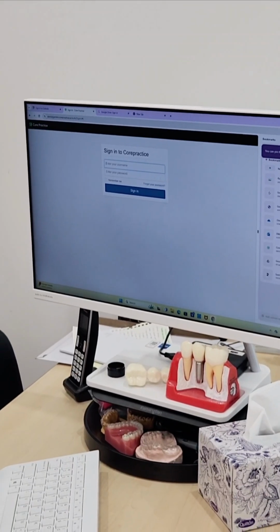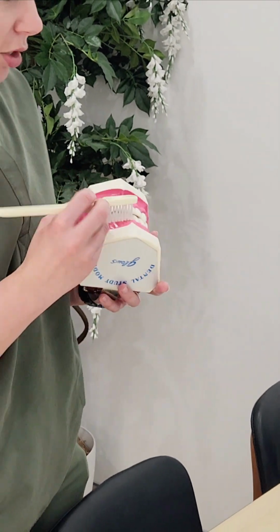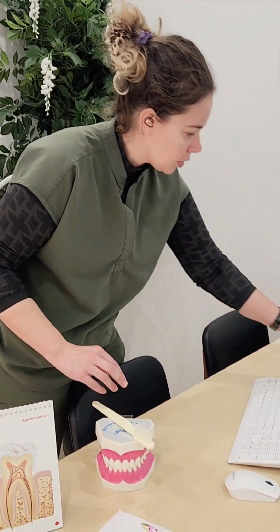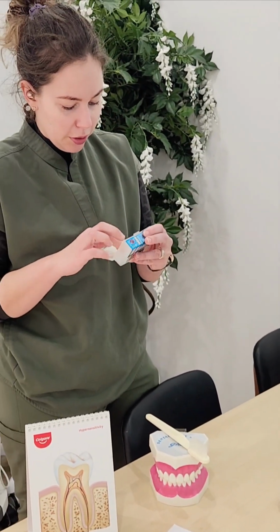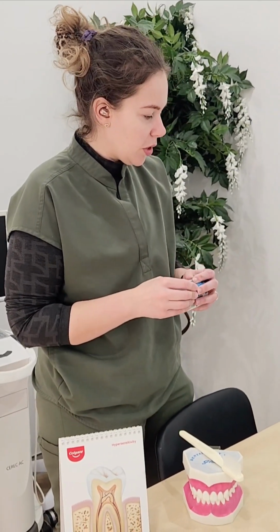Usually you would just go in core practice. You can bring up your photos, x-rays, talk to the patient, explain the treatment plan. Then we've got the toothbrush model if you want to teach them toothbrushing technique. I usually just leave some floss here so I can show them how to floss as well. There's some pictures here, but we only have 2 and they're really big, but you can just explain to the patient.